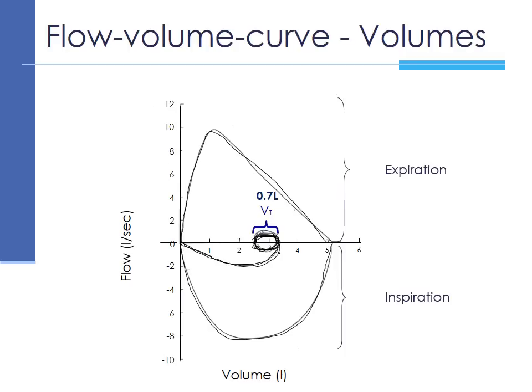And that is about 0.7 liters in this case, because if this is 2.5 over here and this is 3.2 over here, then this volume is about 0.7. Remember, volume is being measured on the x-axis, so we are looking at the x-axis going this way, so the volume would be 0.7.